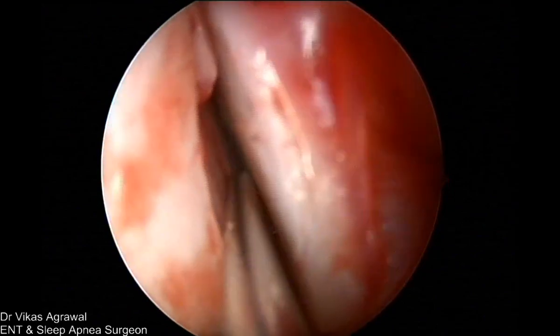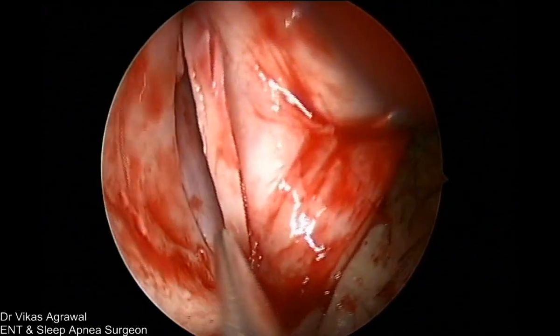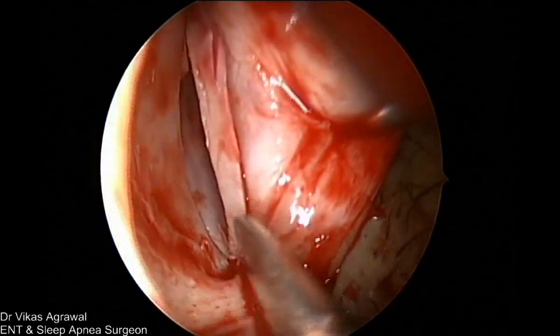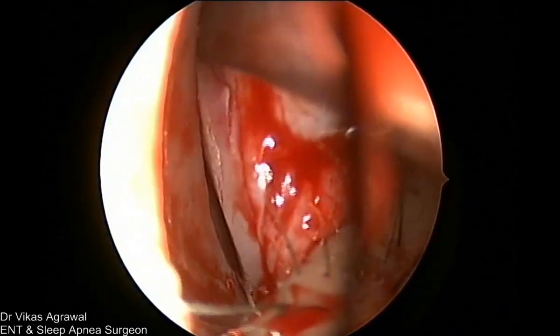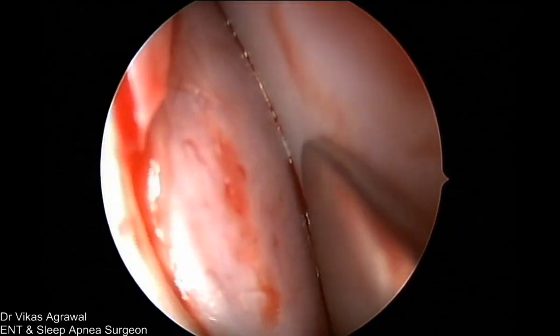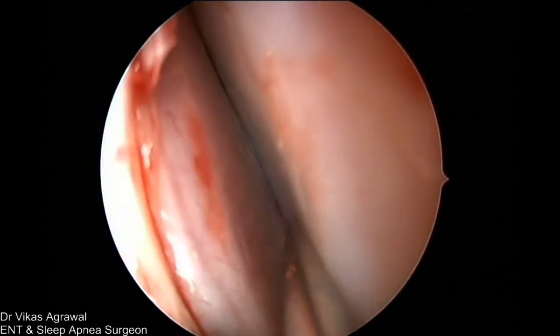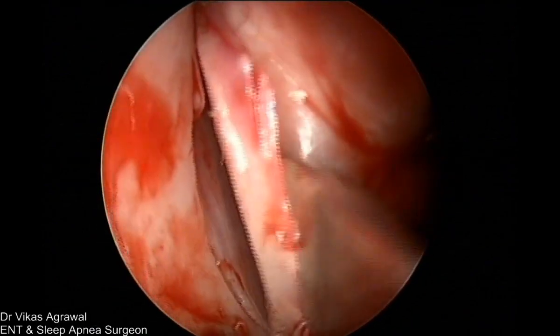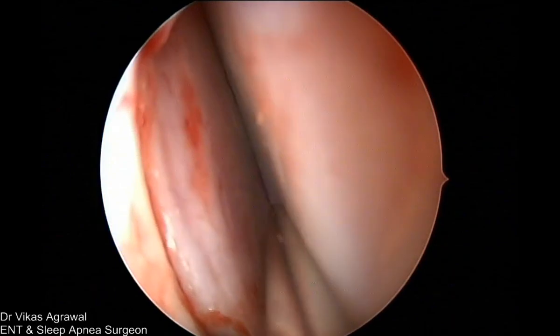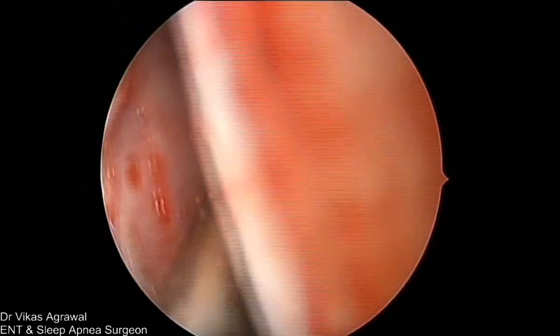Now, how much cartilage can you remove? Anything behind the anterior nasal spine and the junction of the nasal cartilage with the nasal bones, you can remove. And you have to be in the correct plane. If you are in the correct plane, there is no bleeding. If you leave even a little bit of a layer of perichondrium, it will keep on bleeding. If you are in the correct plane, it is as bloodless as this.